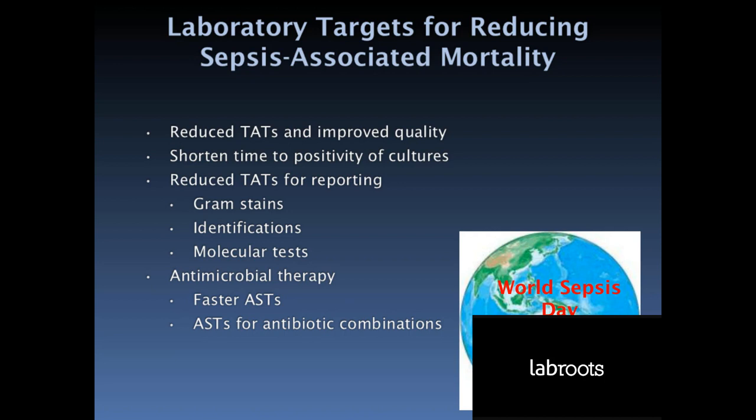Okay, thank you. Our next question, could you provide more details about the EUCAST RAST test and Accelerate Pheno test? I think the Pheno is a neat concept. We looked at it a couple of years ago, and I didn't think it was ready for prime time because we had consistent problems with certain antibiotics. I think ceftazidime and cefepime might have been ones that we didn't get answers that agreed with microdilution. The RAST test is pretty simple. We just have to be able to read a susceptibility test by measuring the zone diameter.